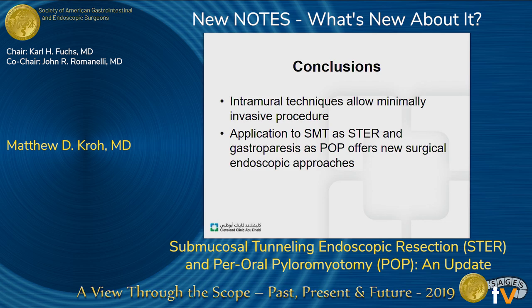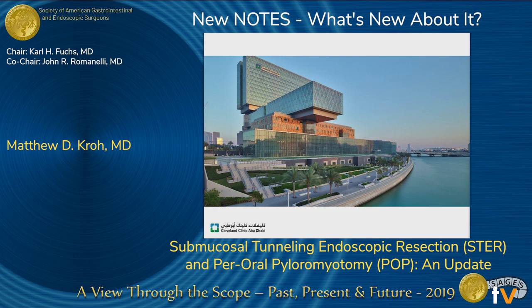So in conclusion, intramural techniques allow a truly minimally invasive approach. Application to submucosal tumors of the proximal GI tract for STER and gastroparesis as POP offer new surgical endoscopic approaches mirroring our laparoscopic operations. Thank you very much for your attention.